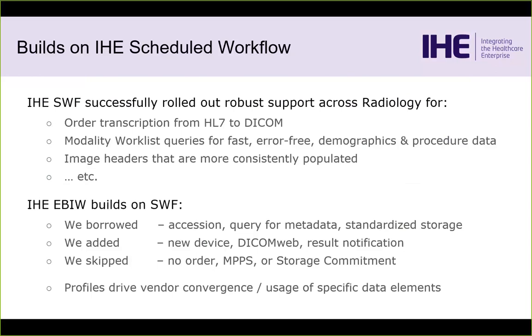Essentially, every modality, PACS, RIS, VNA that you buy today has implemented Scheduled Workflow to coordinate how the orders are passed around, how they're transcribed from HL7 to DICOM, how the modality worklists pass the information down, how that all gets rolled into the images, et cetera, et cetera. And so it's proven to be extremely effective, and most radiology and cardiology departments are finding things are running pretty smoothly today. So the goal was, how do we leverage that?